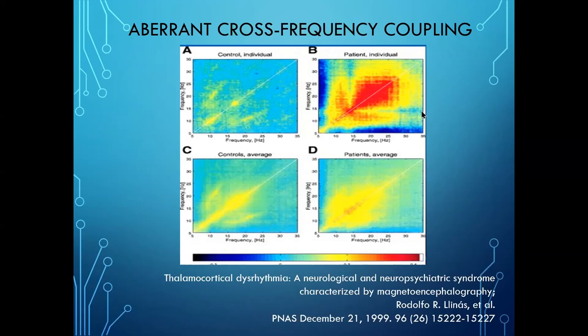And this doesn't go up into the higher frequencies, but what you basically see here is the clinical group. When they grouped together all sorts of patients, averaging them together, they saw cross-frequency coupling expanded. This is just all the controls averaged together, and again, you see activity at the 45 with some simple harmonics from the alpha. So the cross-frequency coupling is apparently something that can identify pathology in the brain. It's, you know, all patients averaged together. Apparently, it's one of these foundational failure modes.